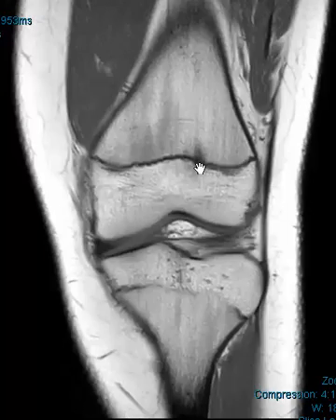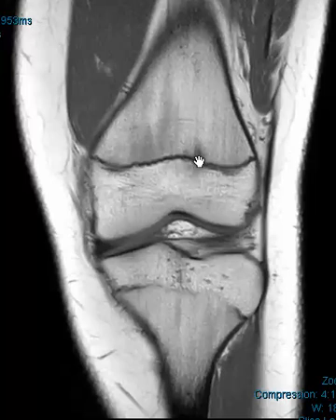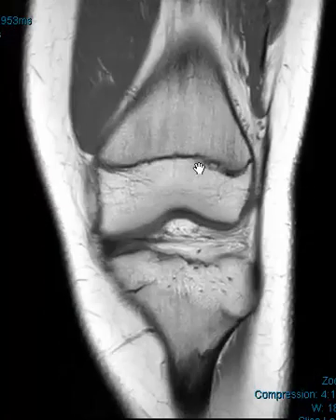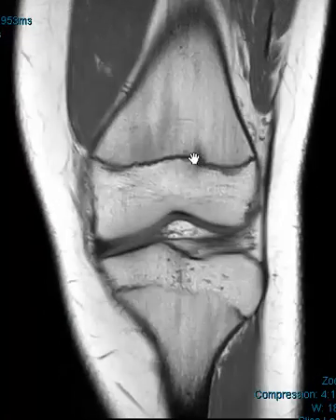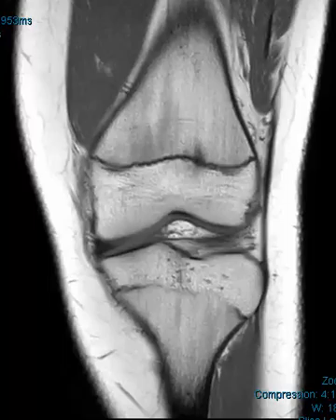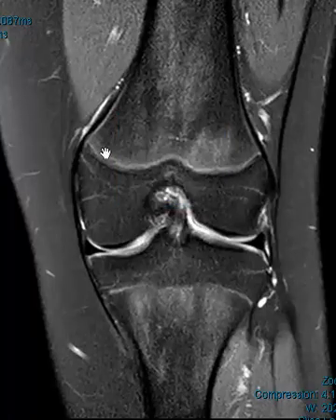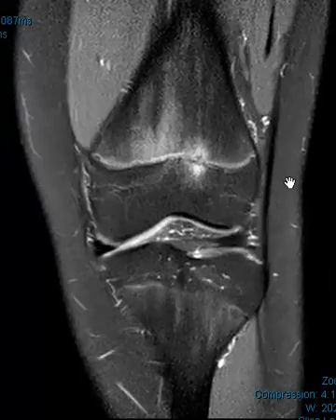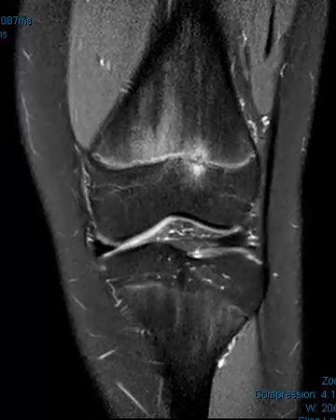This is an area where the growth plate is beginning to fuse. When it fuses focally like this, they call this focal periphyseal edema — the FOPE zone. We'll see in another view that there is some marrow edema around this. As a growth plate begins to fuse, it may start focally like this, causing knee pain, and then over time when it fuses the rest of the way, the pain will go away and become stable.